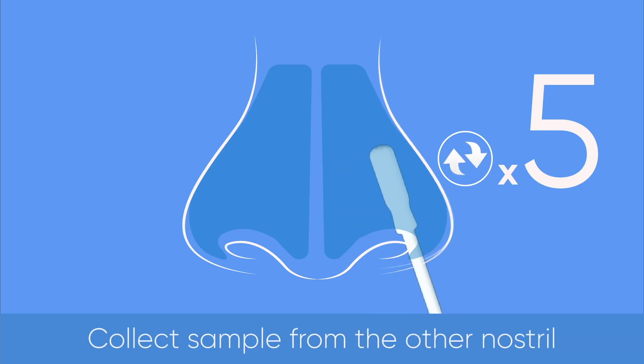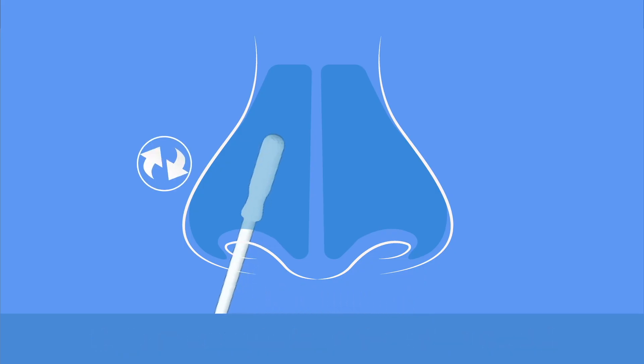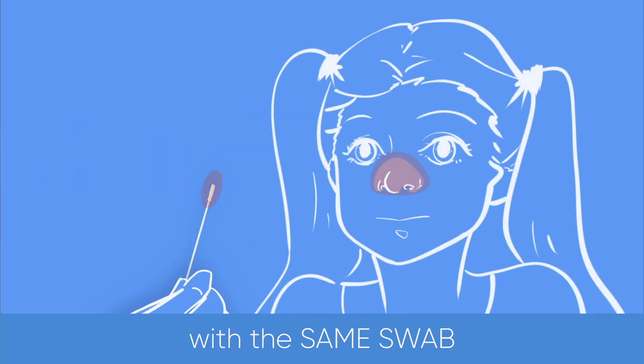Collect a sample from the other nostril. Be sure to brush both nostrils with the same swab.